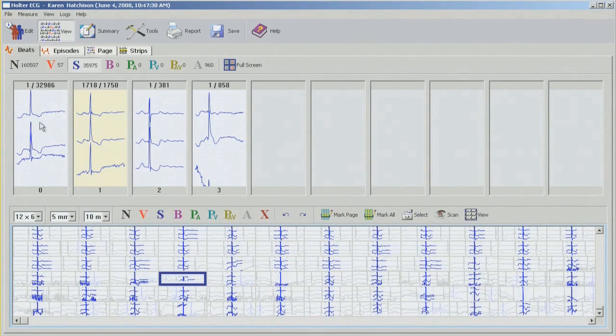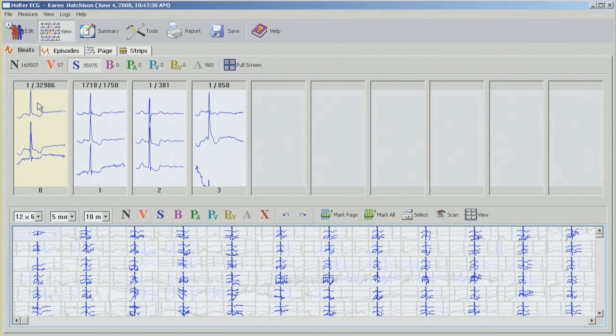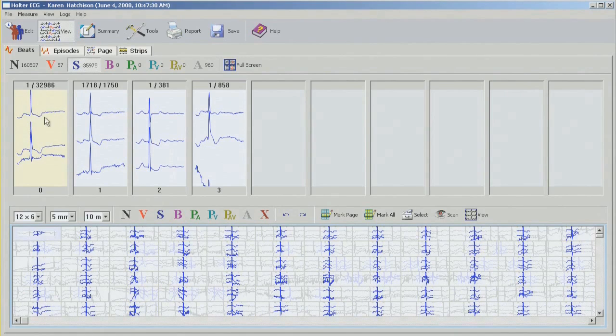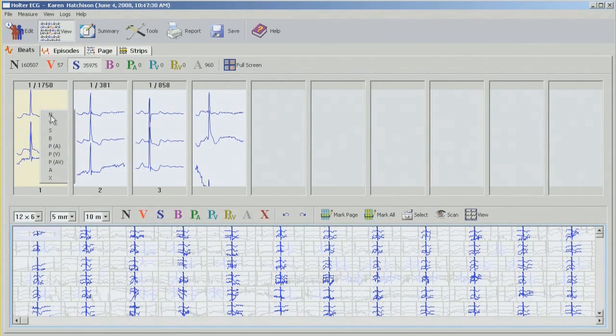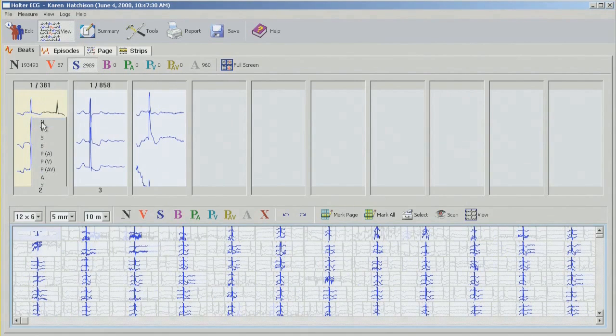I might as well start now. So all these beats, almost 33,000, are going to be changed into normal. So what I'm going to do is just while I'm in the bin, right click and change to normal. Now the second bin as well. Right click, change to normal.